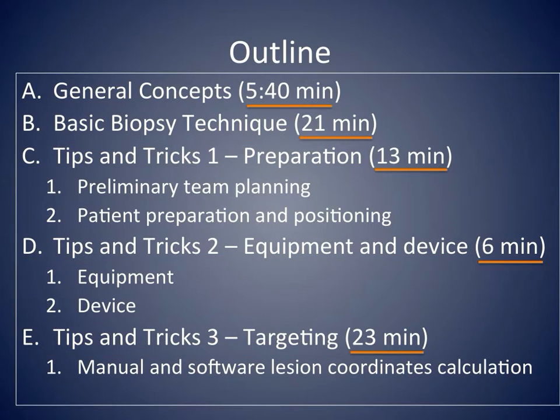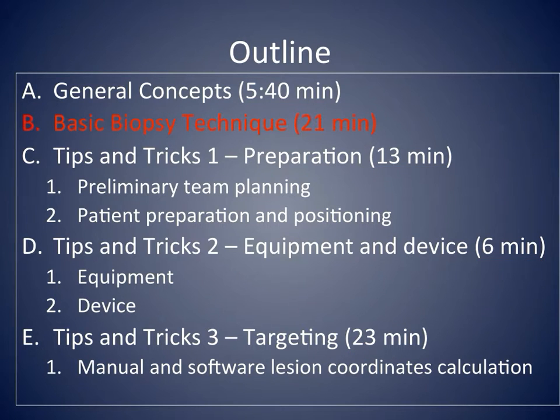The duration of each section is shown here, and the links for each section are listed in the YouTube description of the video. This video has Section B, Basic Biopsy Technique. This video may be of interest to radiologists new to this procedure, radiology residents and fellows in training, as well as MRI technologists performing this procedure.